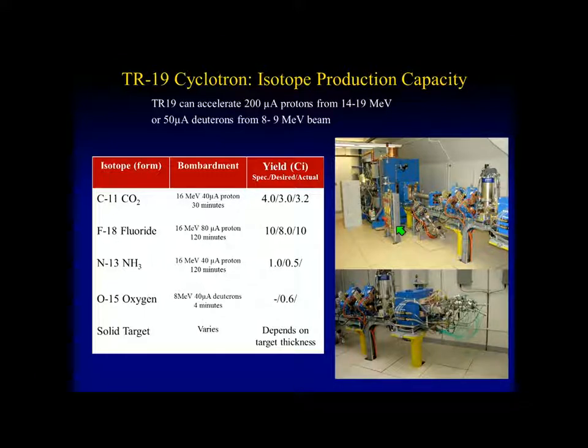But why is that a disadvantage? It's essentially we activate the machine. It's a much higher risk because you have essentially a radioactive machine once you finish bombarding for these various nuclides. And so they have to be kept away from everyone. Our positive ion machines are actually in the basement below our basement. So they're certainly kept away.